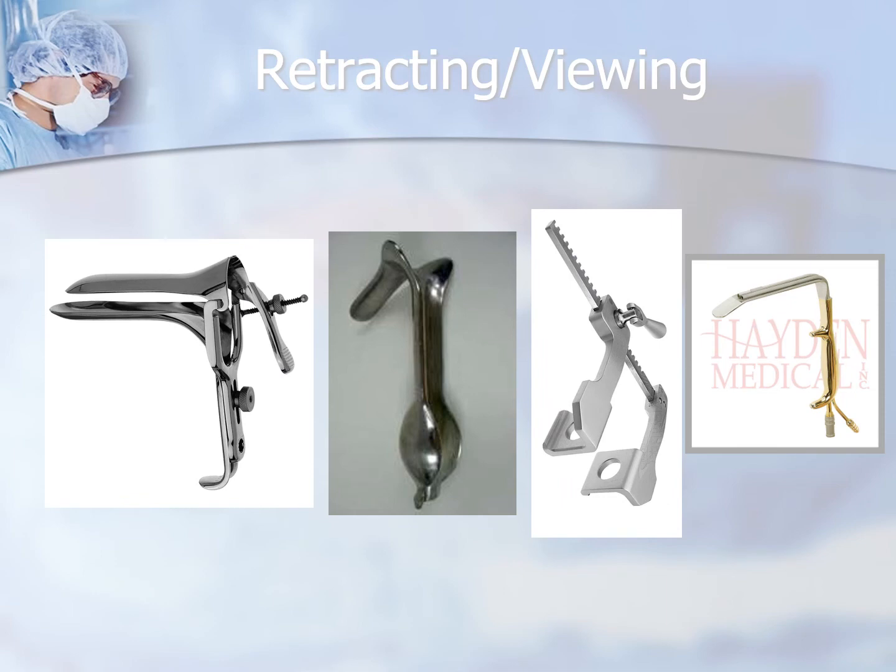Retracting and viewing, we know, can be handheld or self-retaining. An example of a self-retaining retractor that is used in the vagina is called the Graves speculum. That's the first one on the left. Also sometimes called a duckbill or just a vaginal speculum.